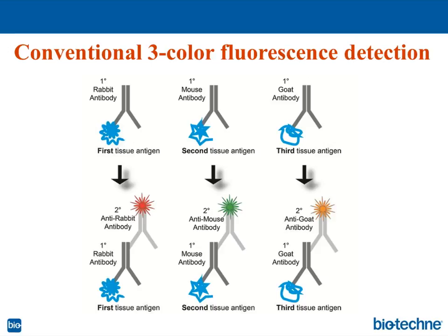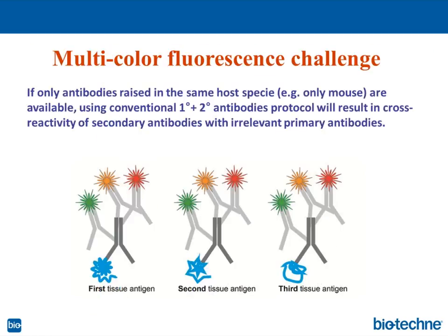But what is going to happen if we have primary antibodies raised in the same host species and we want to detect them using different colors? If we use primary rabbit antibodies and then anti-rabbit secondary antibodies conjugated to different fluorophores, all the secondary antibodies will cross-react with each primary antibody. In the end, we will see complete overlap in colors and will not be able to tell which color depicts which antigen — that's the major problem.